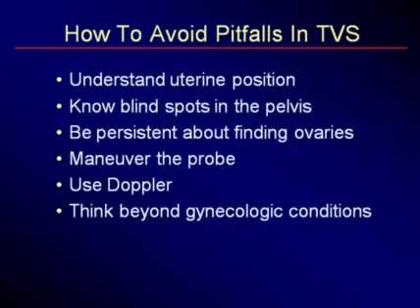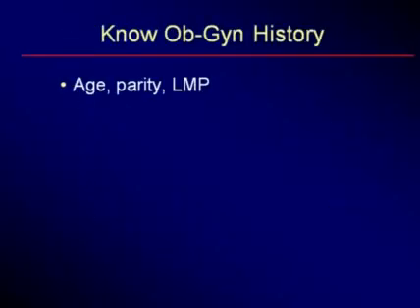Know the blind spots in the pelvis. Be persistent about finding ovaries. Maneuver the probe in different ways. Use Doppler at the end and think of things beyond gynecologic conditions. All of these in a stepwise fashion we will discuss here in this talk.